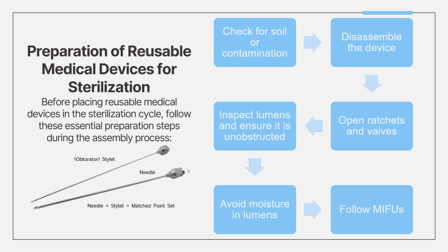And then in the assembly side, the technicians will wear gloves, take a lint-free white towel, put it at this end here, just make sure not to plug it completely, and then blow compressed air through this gap here. And if there's nothing coming out, no brown stains or red stains, it's completely clear. That means the needle is completely cleaned. It's been cleaned properly.